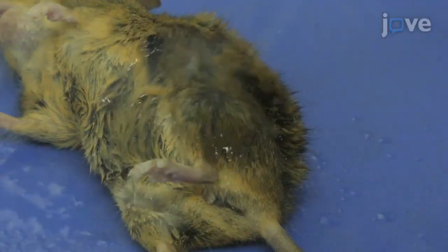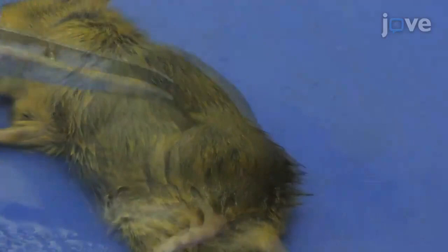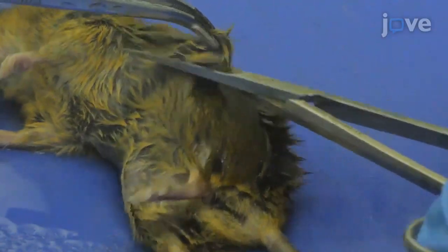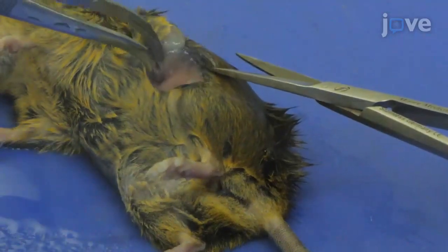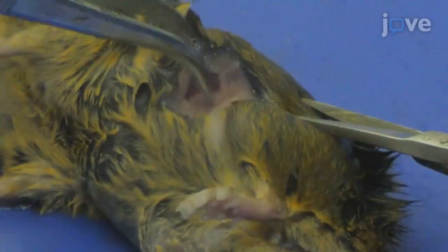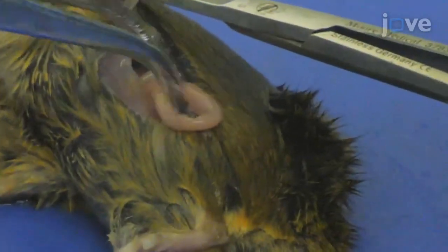Spray a previously prepared mouse trunk with 70% ethanol and wipe it with a paper towel. Place the mouse on its back, slightly tilted onto its right side. Next, cut away the fur using dissecting scissors along the mouse's left side, about halfway between the front and back legs. Using forceps, grab the peritoneum and carefully make an incision without damaging the spleen.